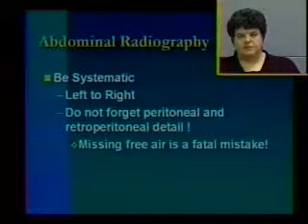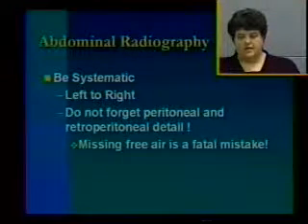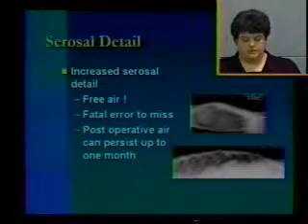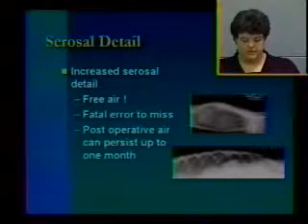And I'm going to harp on this a little bit, but missing free air is a fatal mistake. That dog is going to die. That cat will die if he hasn't had surgery recently. So, serosal detail. There's both peritoneal and retroperitoneal. We're going to talk about them differently.